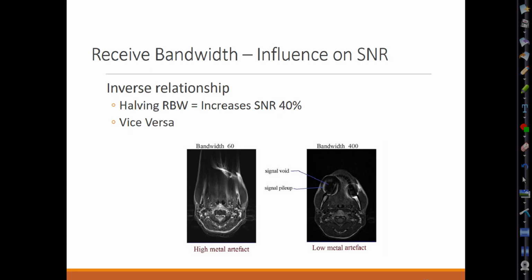Wait, what did you say? Metal susceptibility. Wasn't there an acronym for that? MARS. Oh, MARS, yeah, it's the sequence that you'll see on the scanner. MARS stands for Metal Artifact Reduction Sequence.